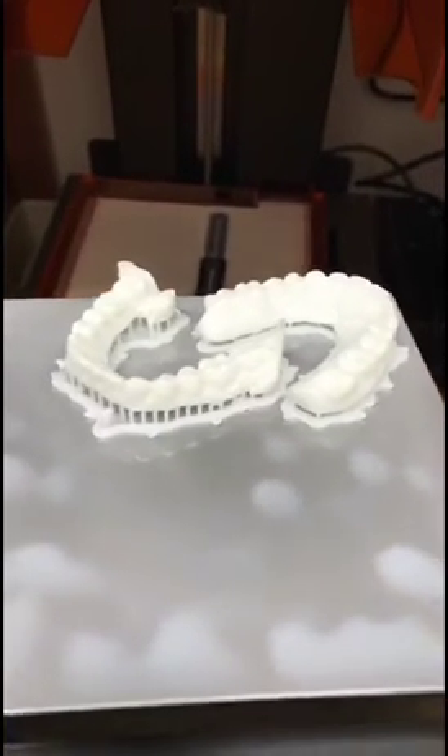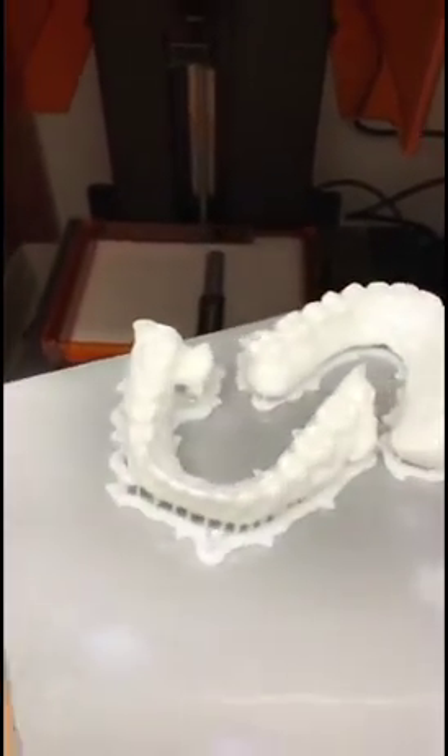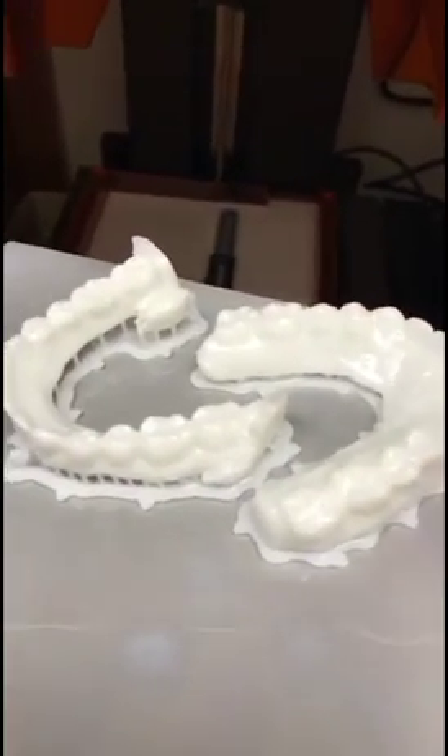Our first print turned out amazing. They look awesome — they look just like my teeth. There's a little extra resin left over, and we'll clean that off now.